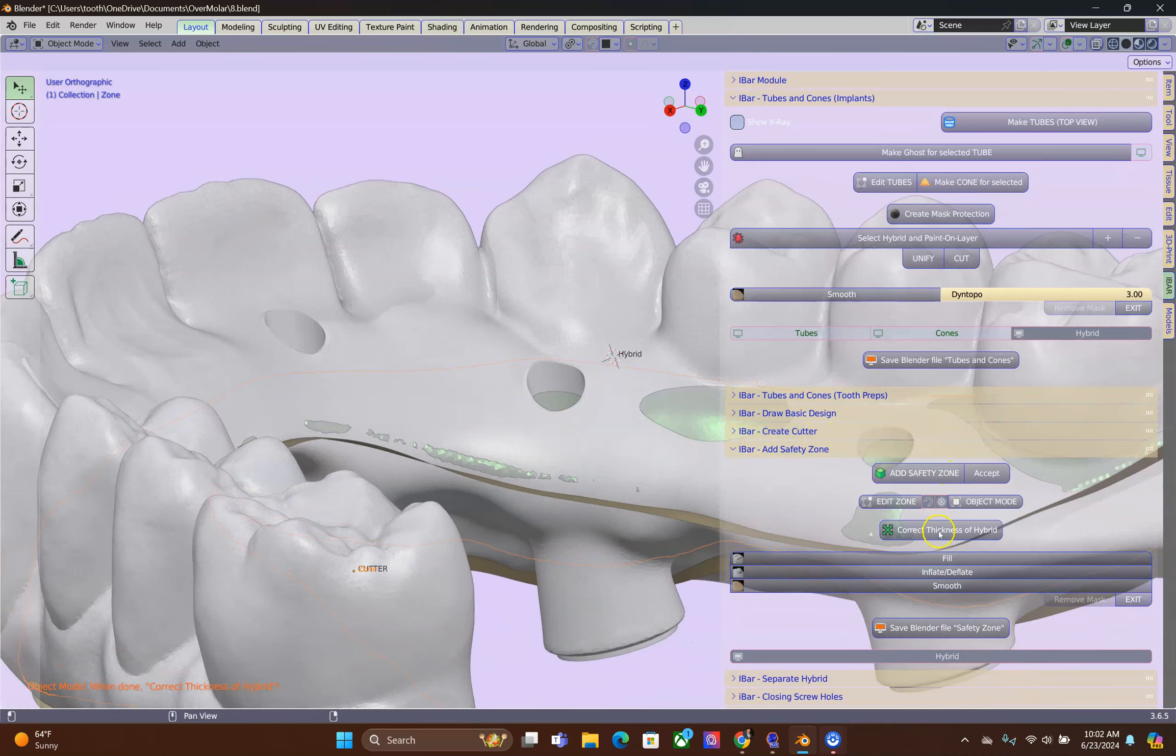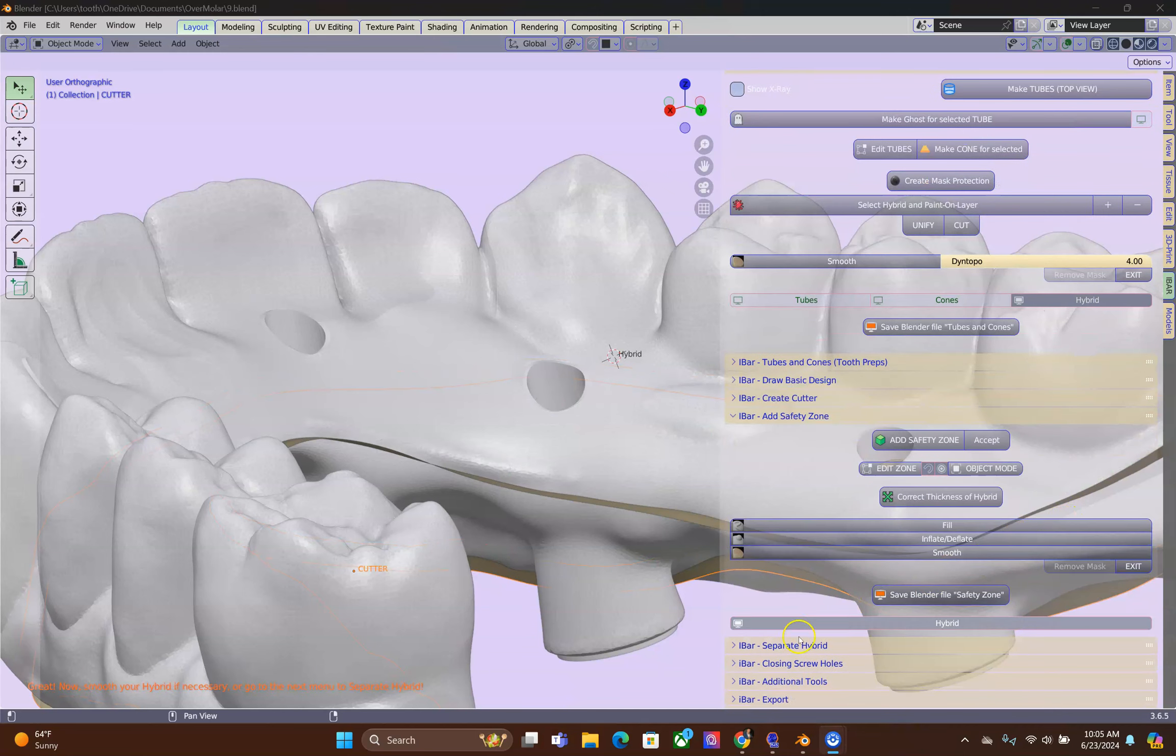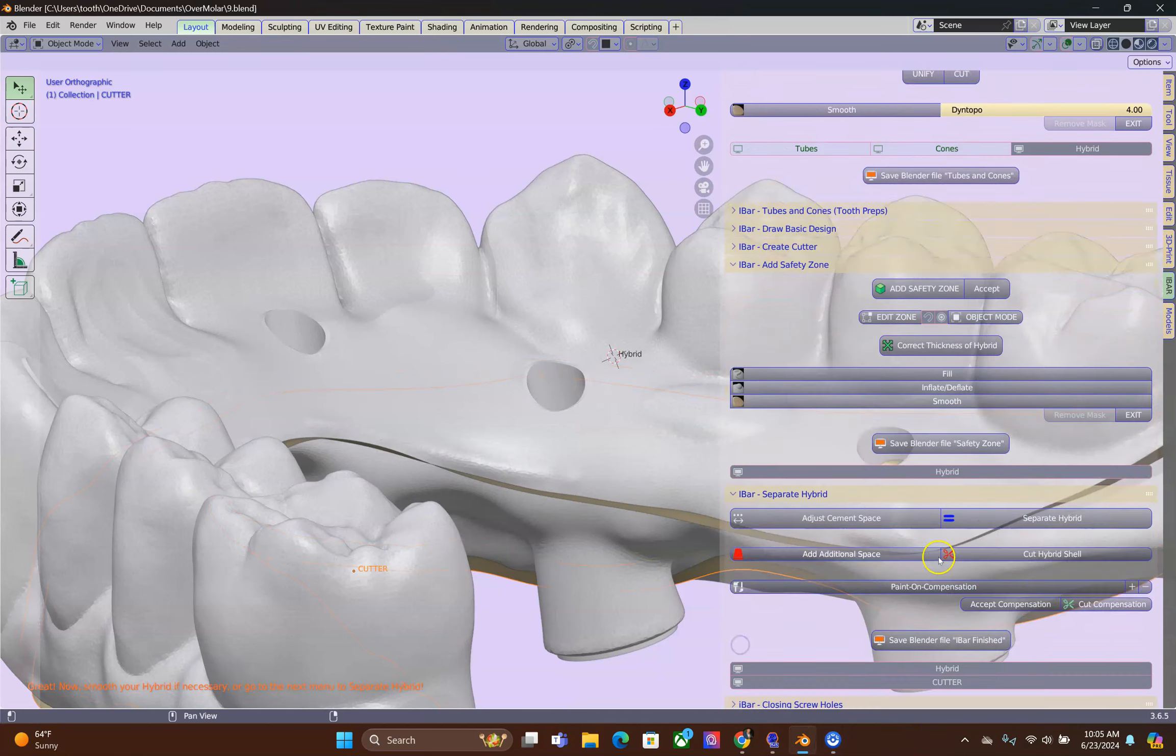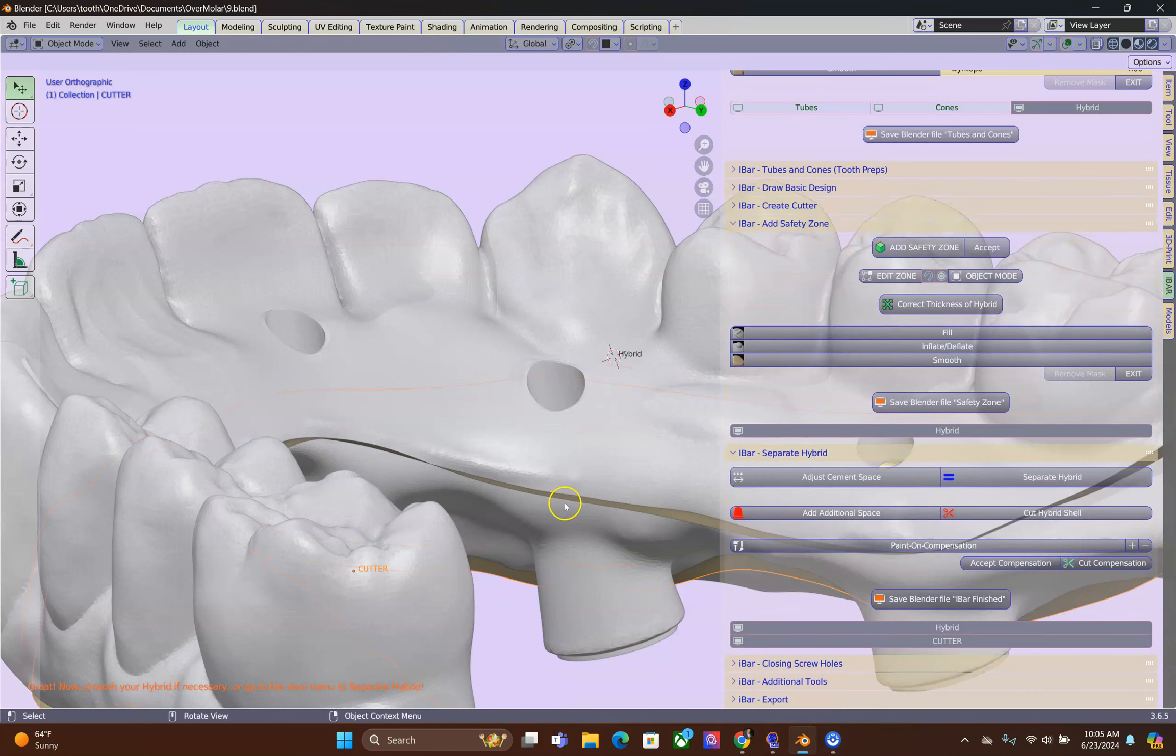Great, we are going to correct the thickness. Finally, it's time to separate the hybrid.